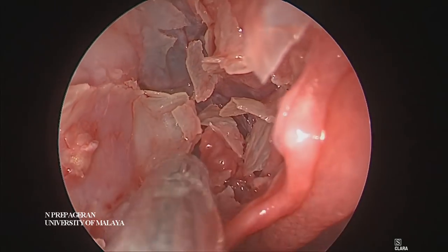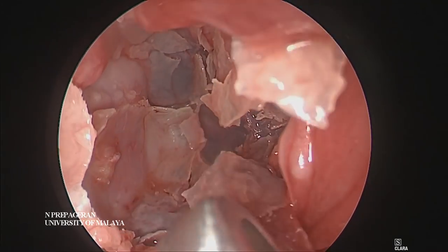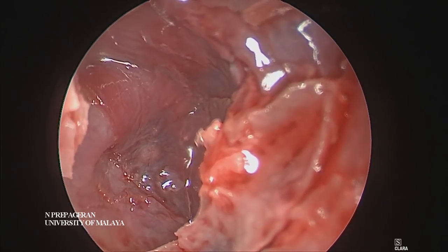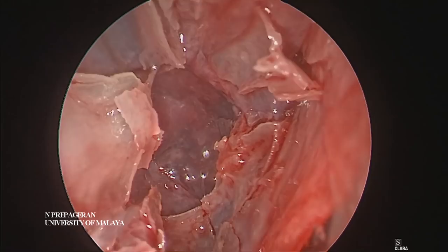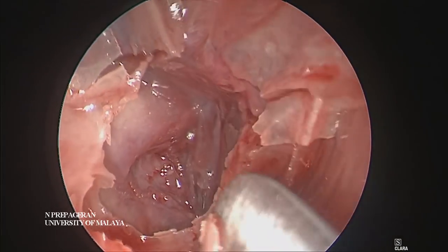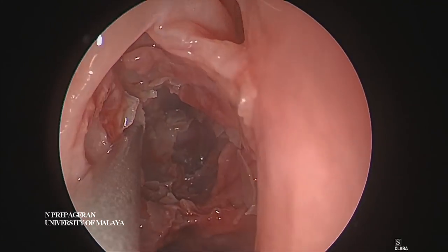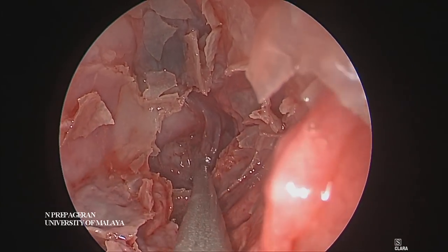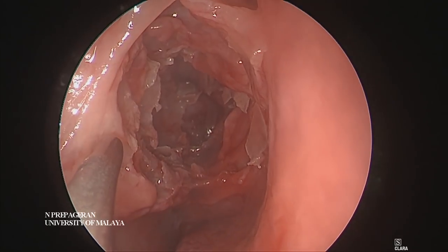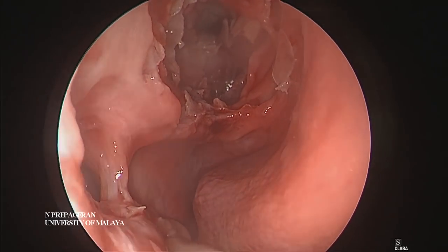So now we are in the sphenoid sinus. Let me remove all these bone spicules. Now based on this, we have opened up gate number one through to the sphenoid. And that's the optic nerve — can you guys see that? That's the optic nerve there, and that's the carotid artery here. Once you can see the optic nerve and the carotid artery, with the optic carotid recess, you know you're in the sphenoid sinus. This is where the orbit would be. You can see the orbit there, and this is the optic nerve. We're in the sphenoid sinus — that's the carotid artery. The uncinate was here, this is where the bulla was, the lateral lamella, and up here would be the skull base. And that's the maxillary sinus there.